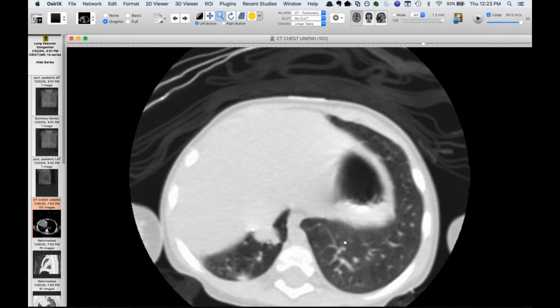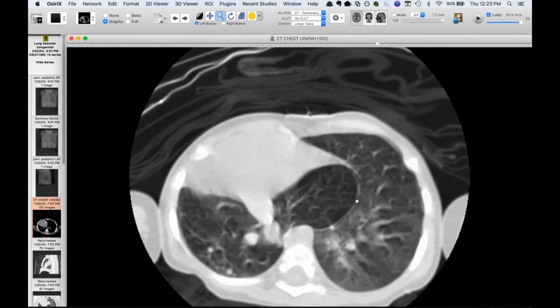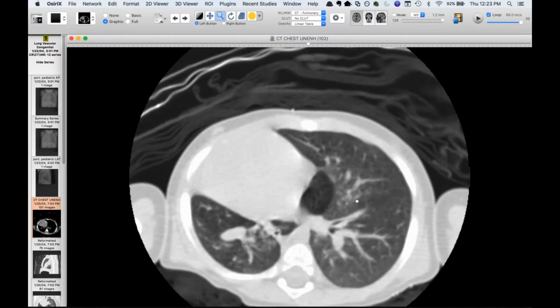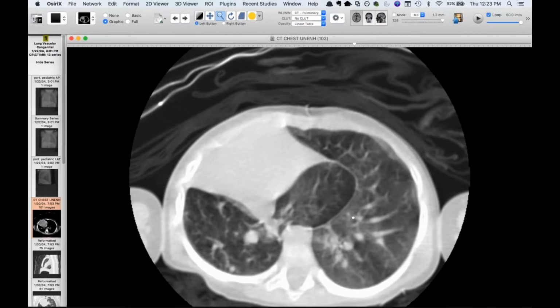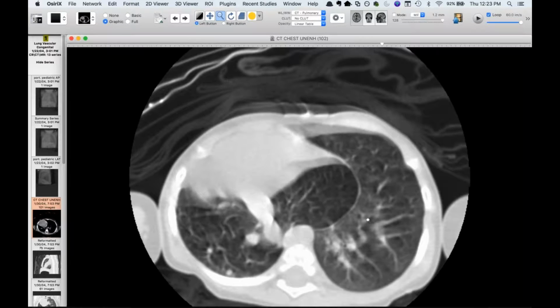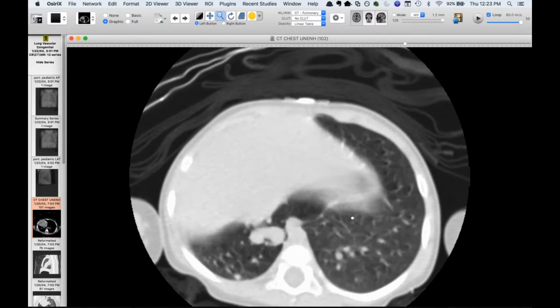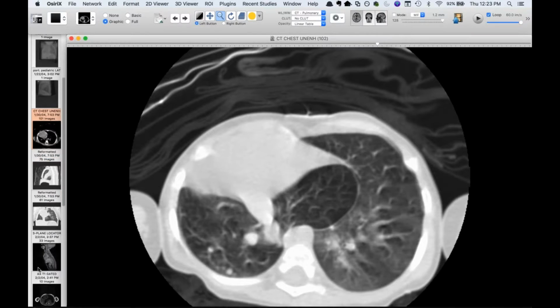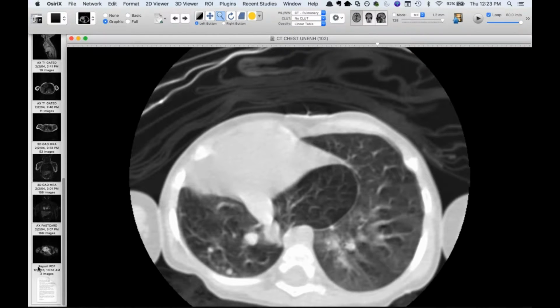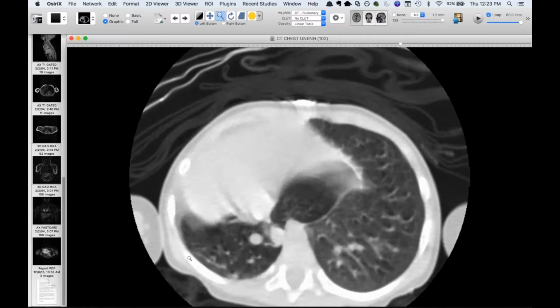And so this is the best example I can find of a horseshoe lung in the setting of scimitar. From the reading I've done, it's supposed to connect to the left lung. There's supposed to be connection of the basilar segments, and here you can still see there's a clear fissure, or I don't know how many layers of pleura there are here, but I still think this qualifies as a horseshoe lung. I don't know if anybody else, David, if you agree or not. Go ahead, David.